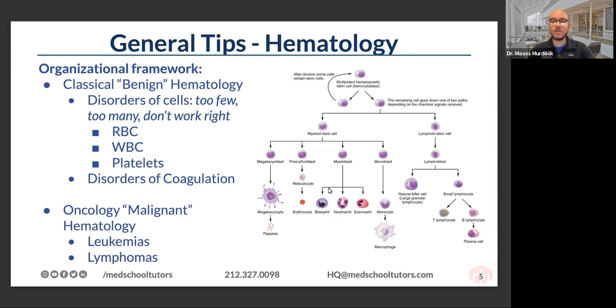the liver. We know that we can divide these cells up based on markers on their cell surface, that they fall into families such as the myeloid families, the granulocytes, the platelets, the red blood cells, and the lymphocytes, and that this organization can help you understand at what level of differentiation the problem is happening, and the resulting clinical presentation. Again, the focus today will mostly be on red blood cells, but you can see a variety of other cellular elements on the blood smear, and so we'll toss some of those in as well.